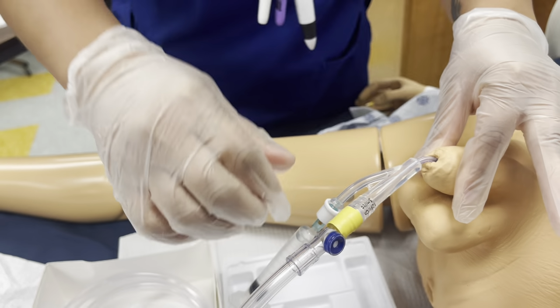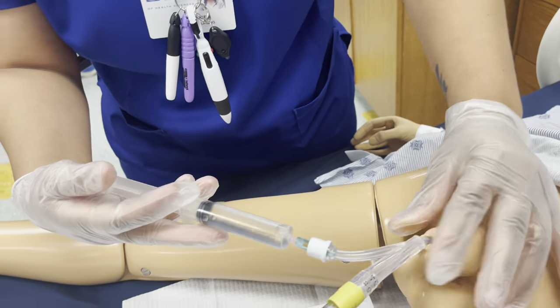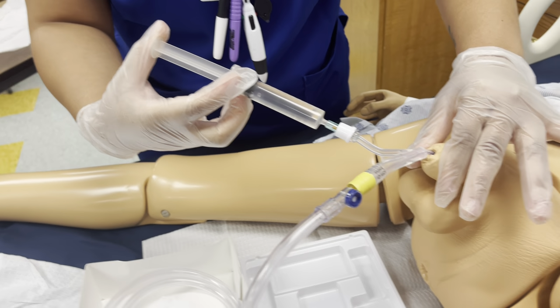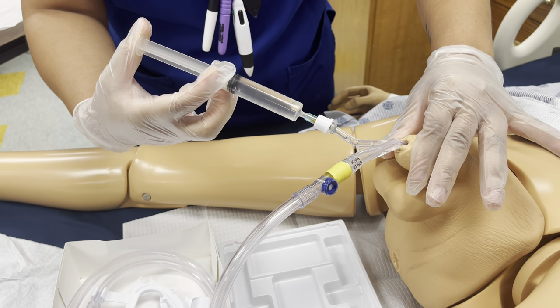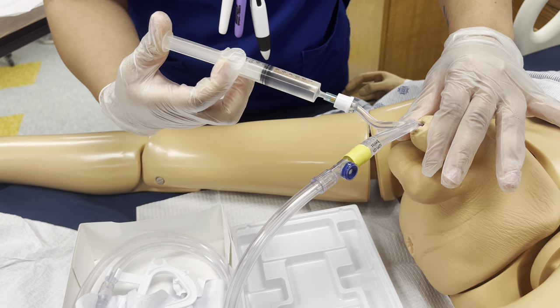Oh, boom. Now we're in. Now this hand is clean, so you can't touch nothing over here no more. Okay, so now I'm going to insert. That's pretty cool, huh?